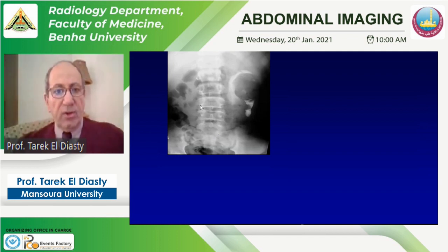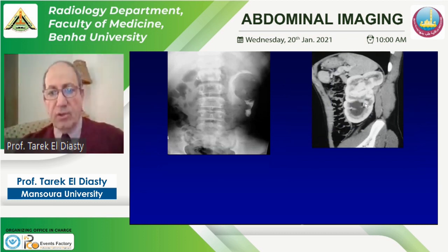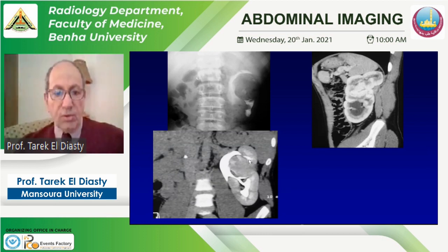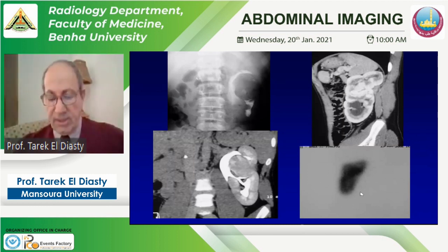Here, the intravenous urography of a patient who underwent right radical nephrectomy for renal cell carcinoma shows surgical clips and a mass effect on the left kidney suggesting a recurrent tumor. But on CT — a sagittal oblique image in the corticomedullary phase — we can see cortical infolding with the same enhancement as the cortex. In the excretory phase, this enhancement of the renal parenchyma confirms a pseudotumor rather than a neoplasm, confirmed by DMSA scan showing uptake. It is a hypertrophied column of Bertin.